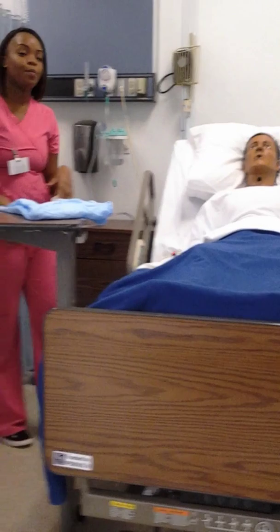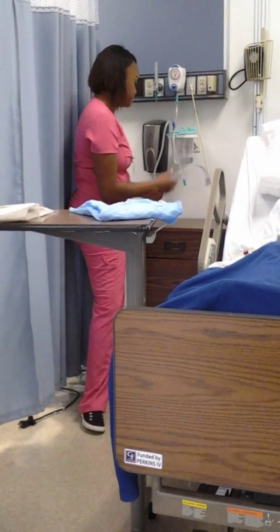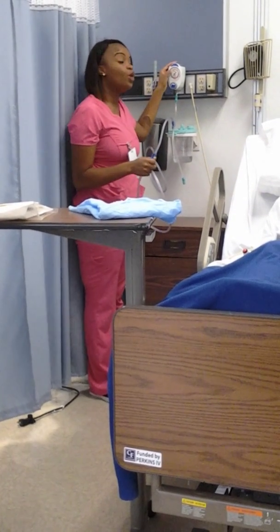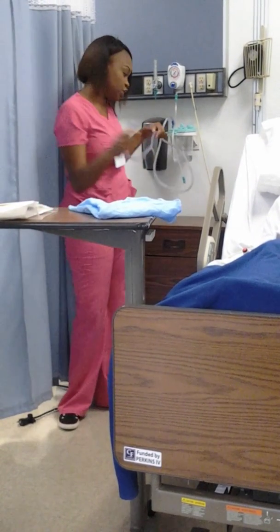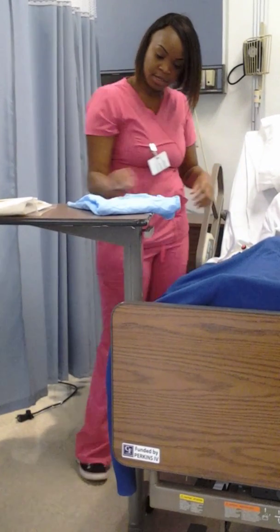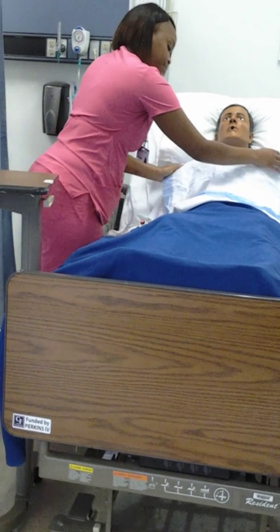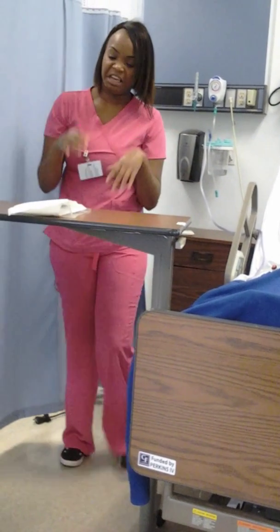Before I get started, I want to turn on my equipment. Go ahead and turn the equipment on. Now this particular equipment, for the suction, it needs to be between 110 and 120. I set it on 120. Here it's suctioning. Just going to bring it over by the bed. Just brought a chucks just in case the secretions get liquefied and just will keep the patient dry. I'm going to just put my extra sterile gloves here just in case.